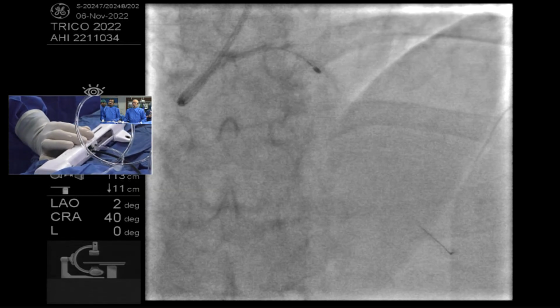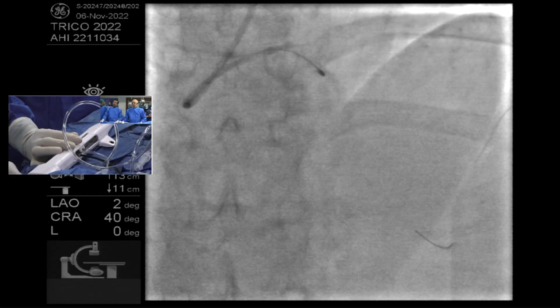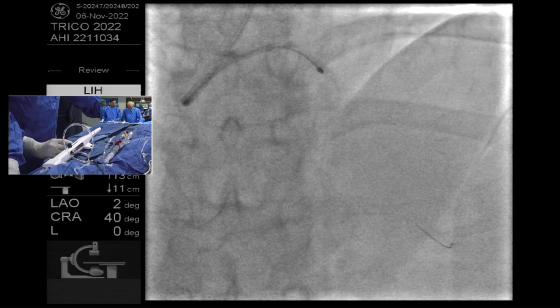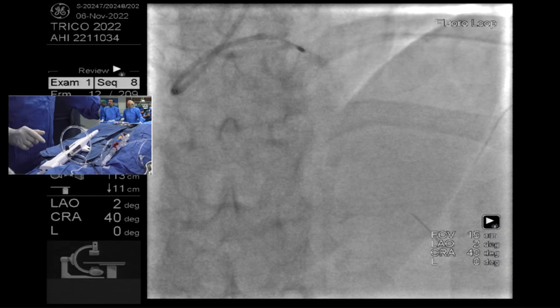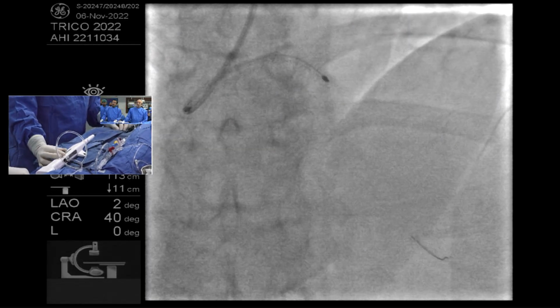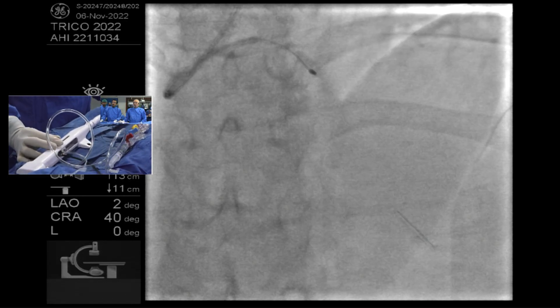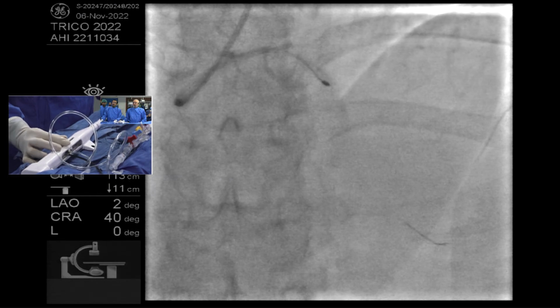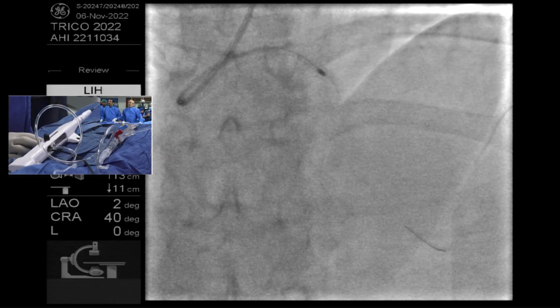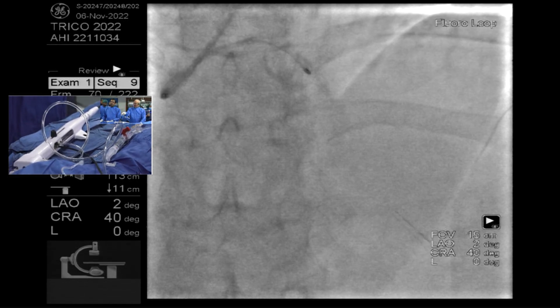I am going very slow. Very slow, buddy. Wait for some time. This is all fluoro recording. I think we might need to increase the speed, right? No, I think it'll go through. It might take a few more passes. You don't need to, because it's not dropping significantly, right? Yeah.